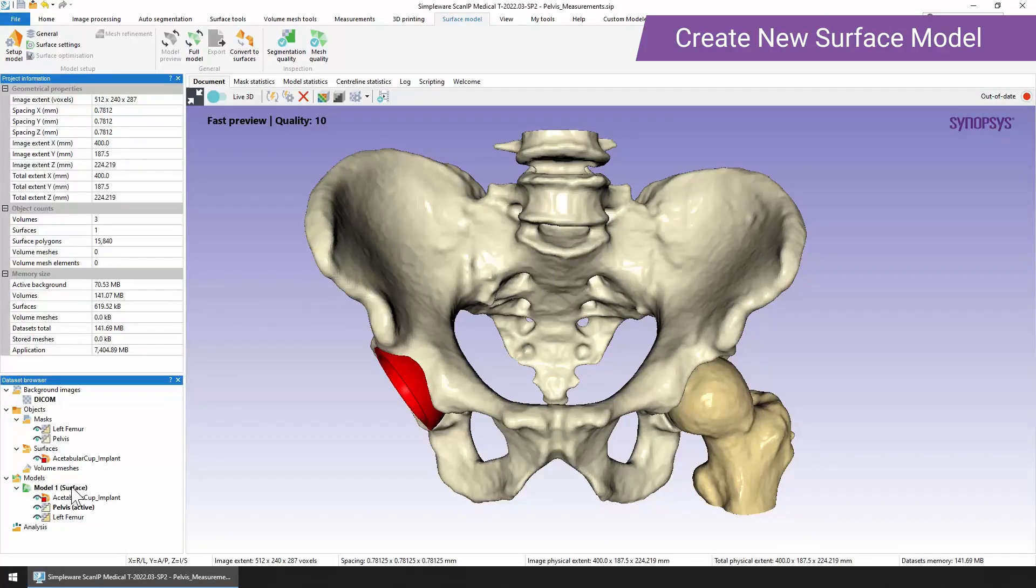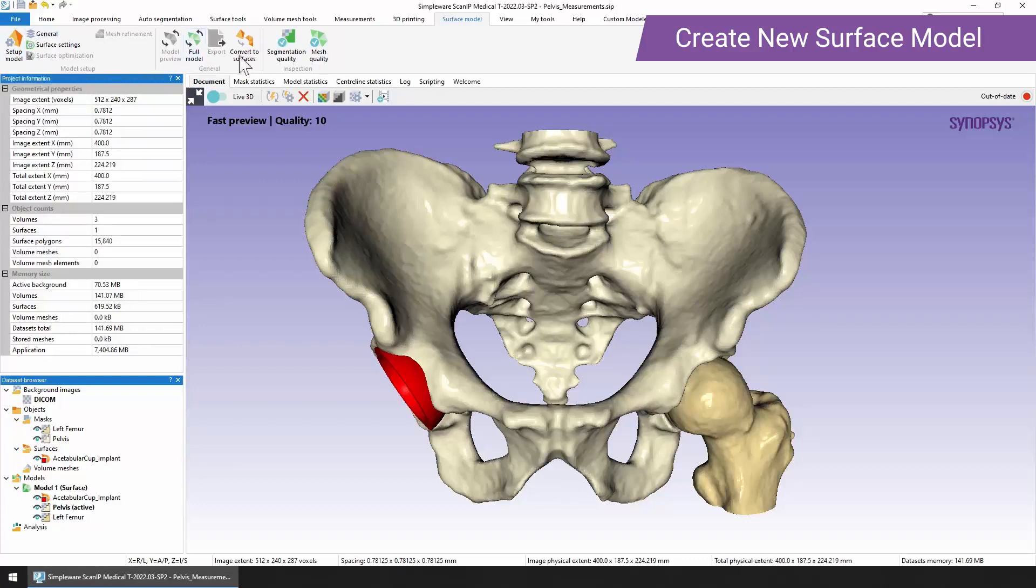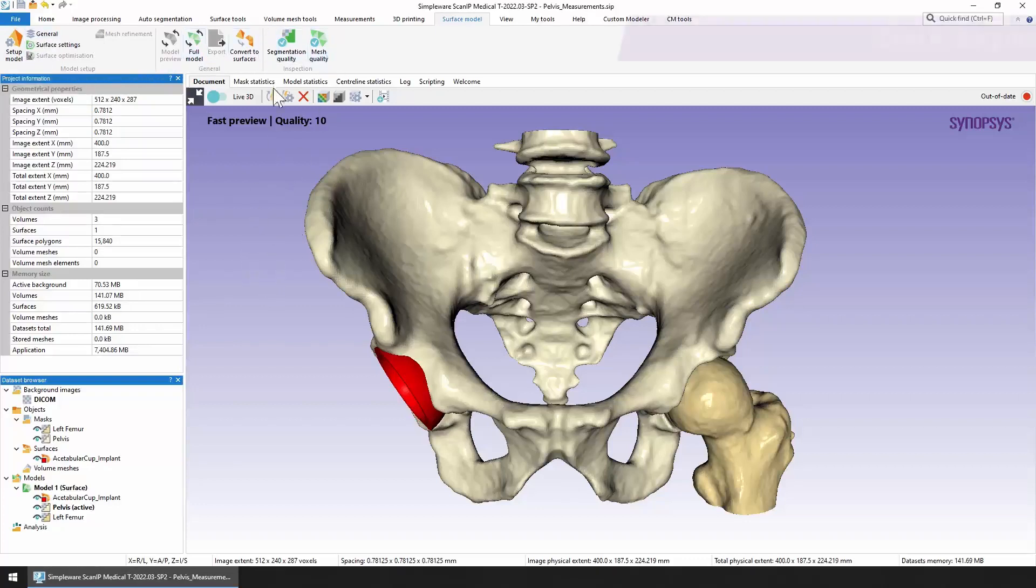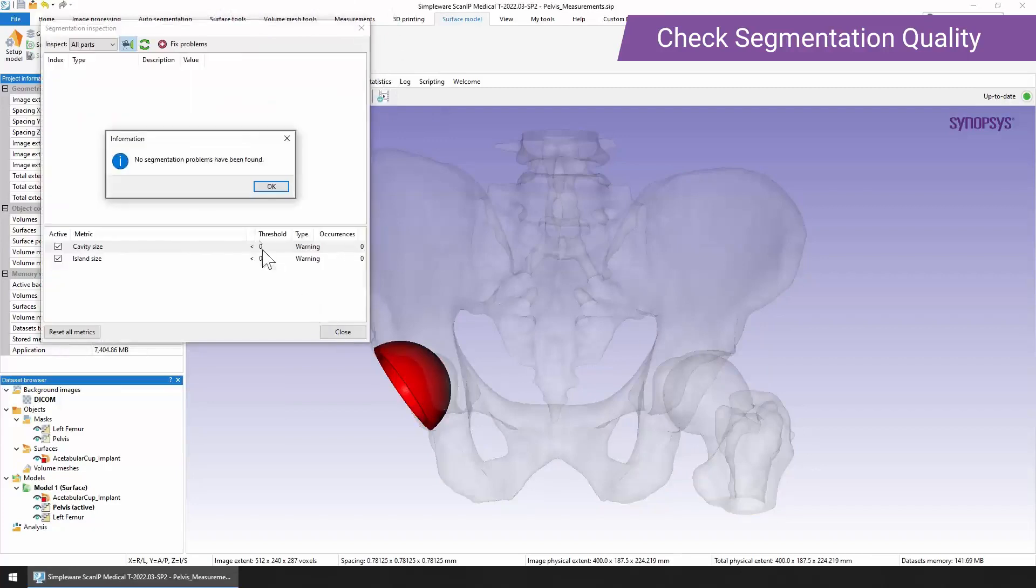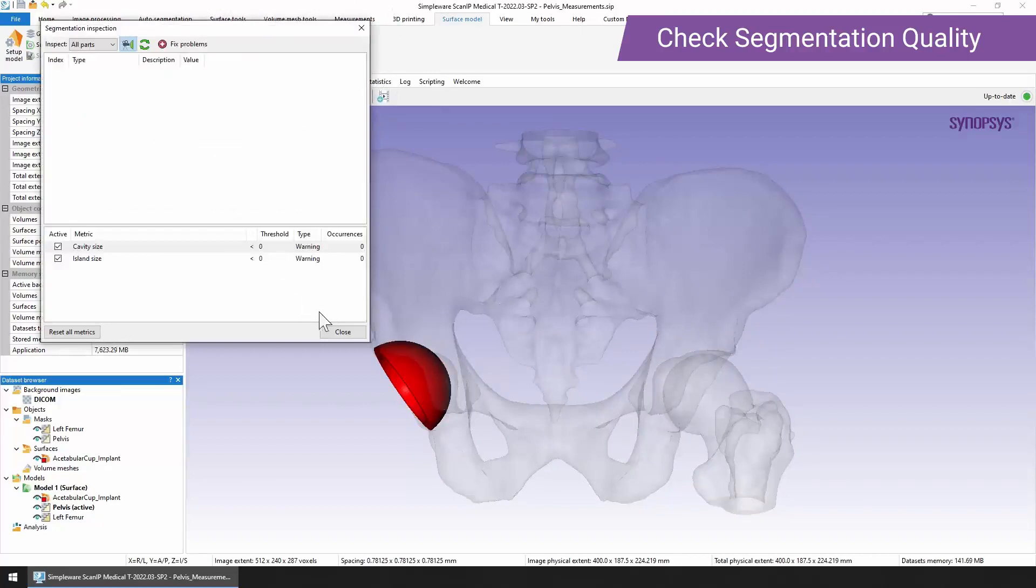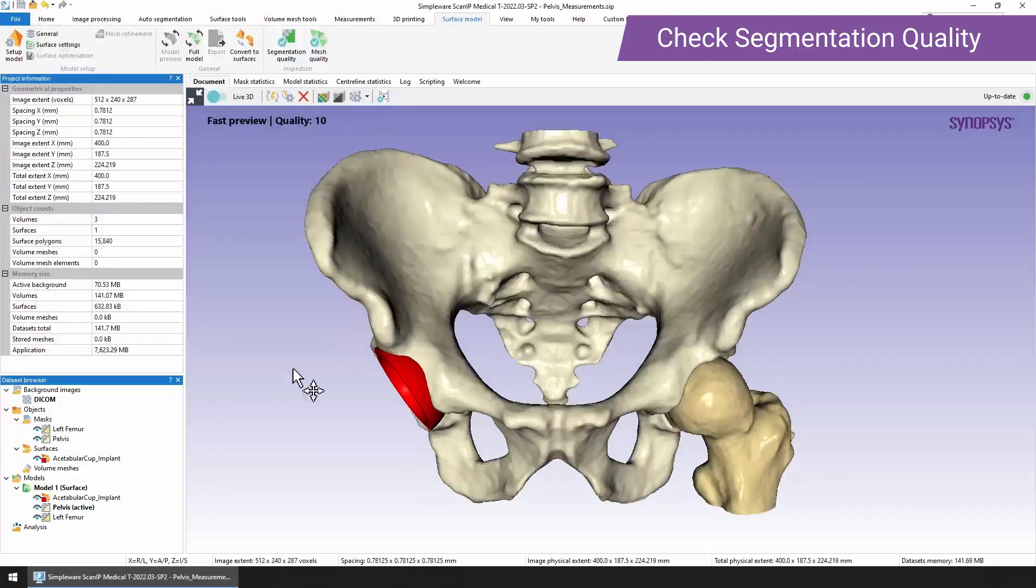What we'll notice is that this is a context sensitive tab here and it automatically opens when you create your model. So here we have the model setup and all of our options. One of the first things that we can do is check our segmentation quality. If we check this here you can see that no segmentation problems have been found. If you do have some you could go back into your segmented masks and maybe make some changes or see if the automatic tool can fix them for you straight away.